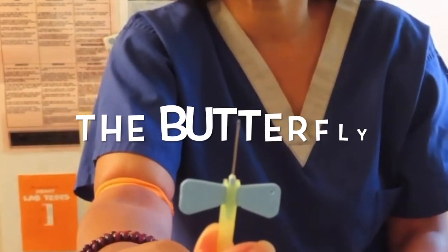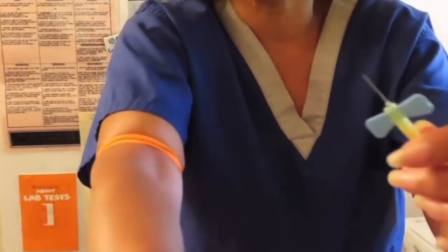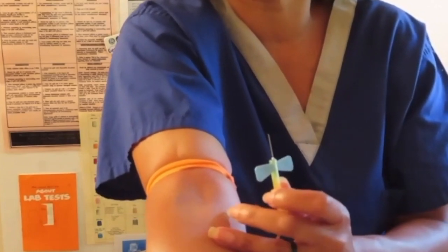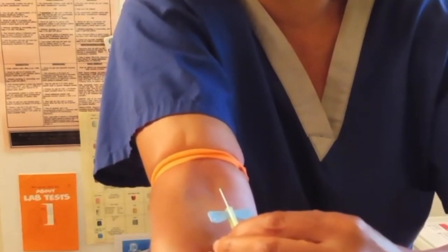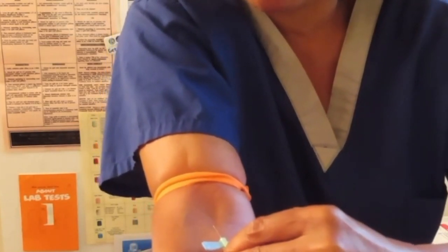Enjoy. Remove our little cover from the needle. Our bevel is supposed to be up. Always inspect your needle and make sure that your bevel is up. So I'm just going to go ahead and get this blood really quick. I'm going to do right here in the center because it looks good and I think it's going to be a doozy for us. So I try to anchor the best I can even though I'm sticking myself.